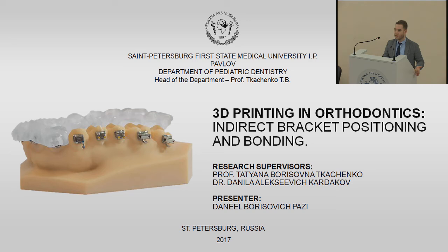For class one patients, that really doesn't matter, because it's not a very bad situation in malocclusion. But basically, what a two-tray method can allow is making fewer errors, especially in the final steps, because sometimes you're using only the inner layer, the soft one. It's really soft, so there can be some errors during actually positioning the tray on the teeth. So we try to use mostly the two-tray method, but sometimes if it's not very hard, we can just leave the hard one out.